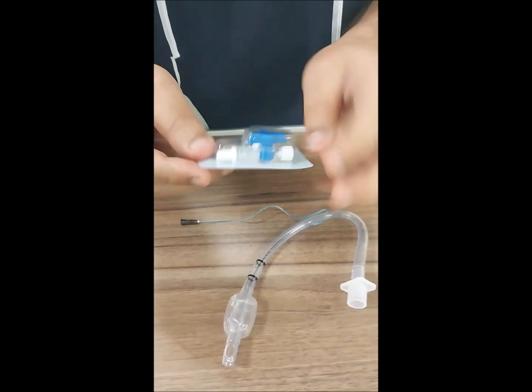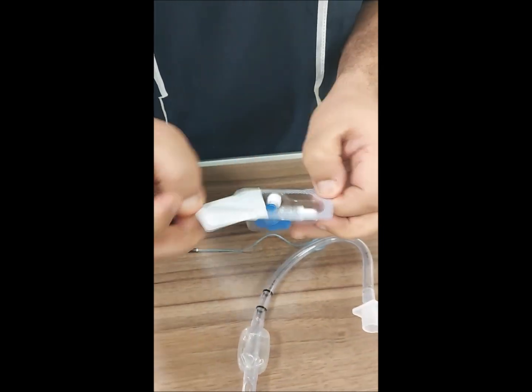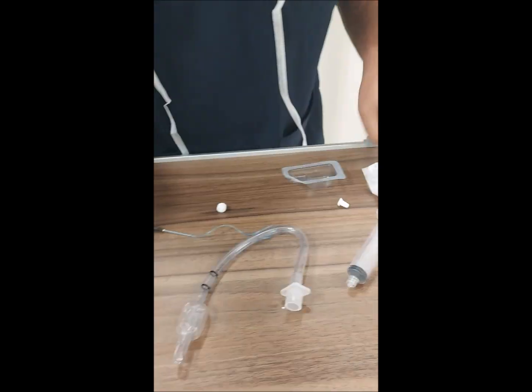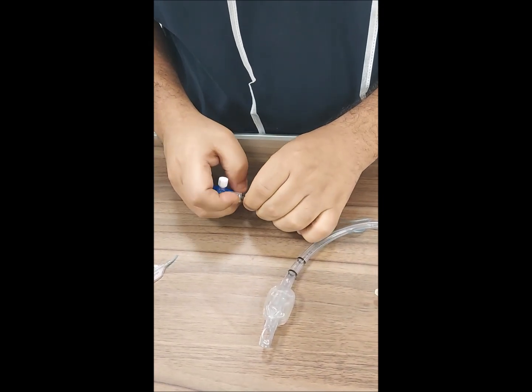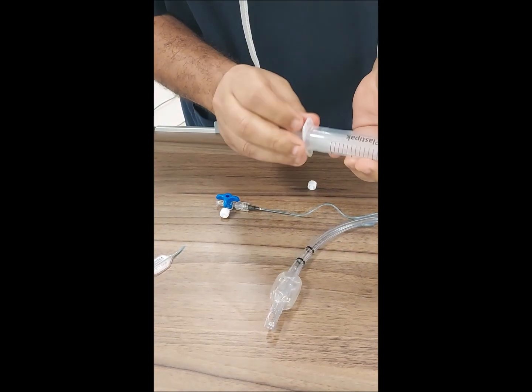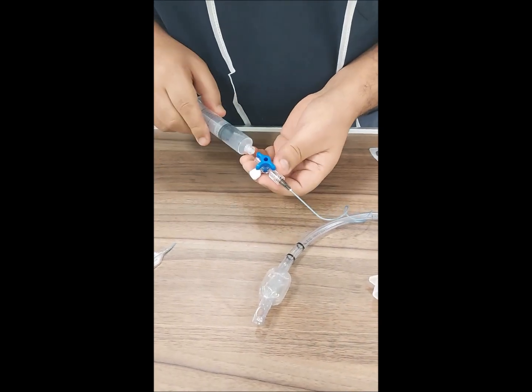Then you have a 3-way. So we replace this valve with the 3-way. Okay. Then you connect the 3-way here. Then inflate the tube as you want.